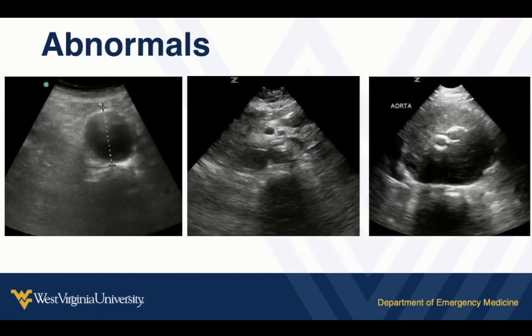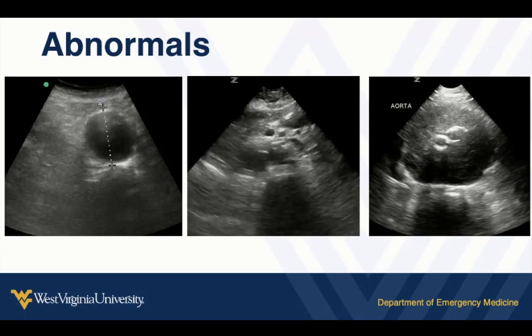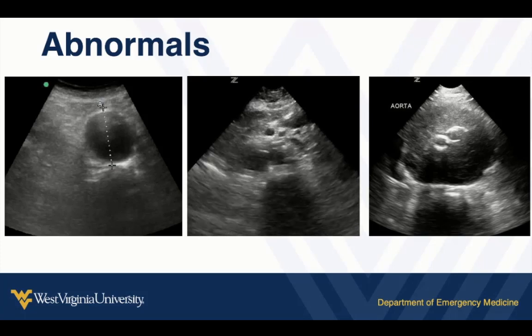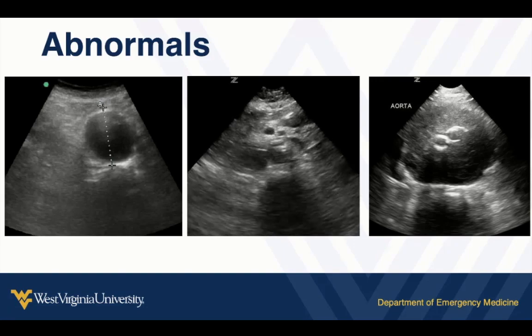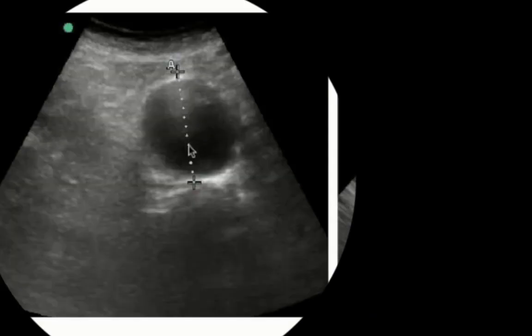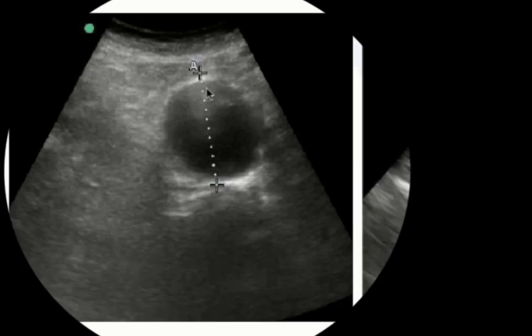Normal aortas have a diameter that should always be less than three centimeters — really two and a half centimeters is about the maximum. The aorta tapers as you go down the abdomen. Our main question most of the time is: is the aorta dilated or not? The most accurate measurement in the transverse view is anterior to posterior, measured from outer wall to outer wall. An aorta exceeding these measurements represents an aortic aneurysm.